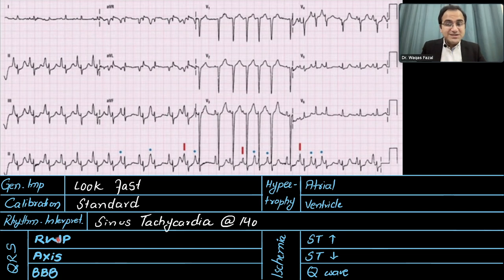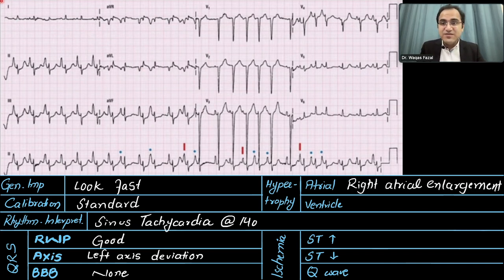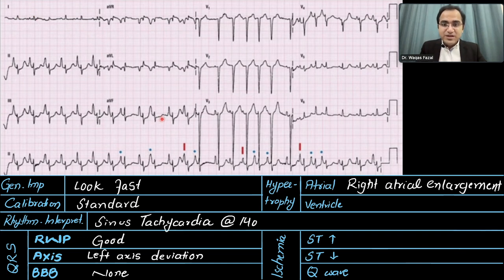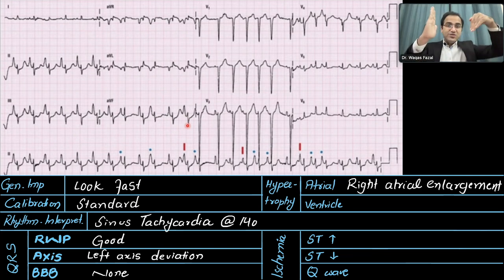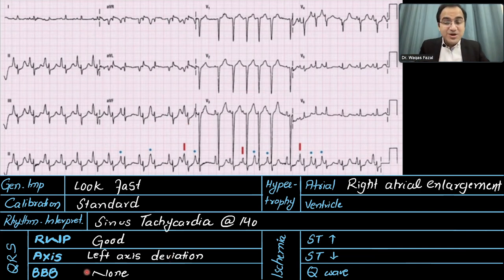For rhythm interpretation, we look at the number of large boxes between two QRS complexes — we have almost two large boxes. One large box equals 300, two large boxes equals 150, so the heart rate is approximately 140–150 beats per minute — sinus tachycardia. For the QRS assessment, in R wave progression the QRS complexes should be negatively deflected in V1, V2 and positively deflected in V5, V6, which they are — R wave progression is good. For axis deviation, we look at lead 1 and lead aVF.